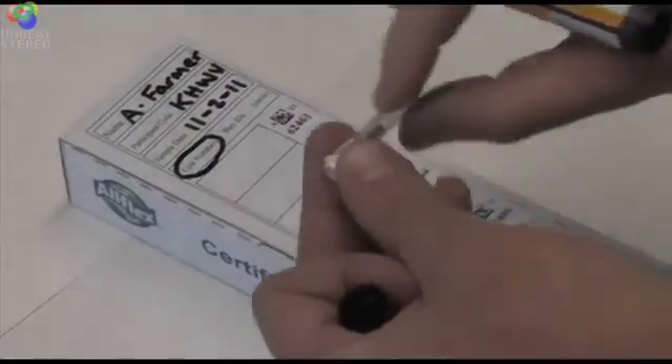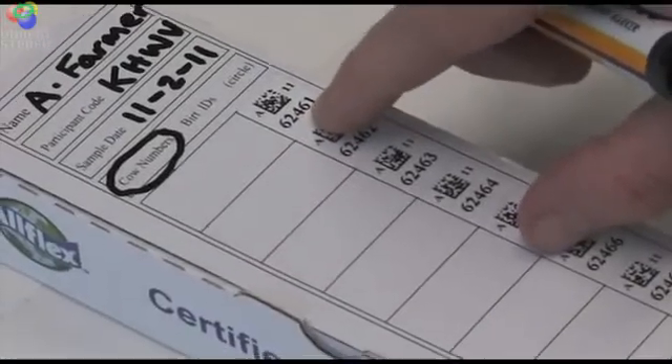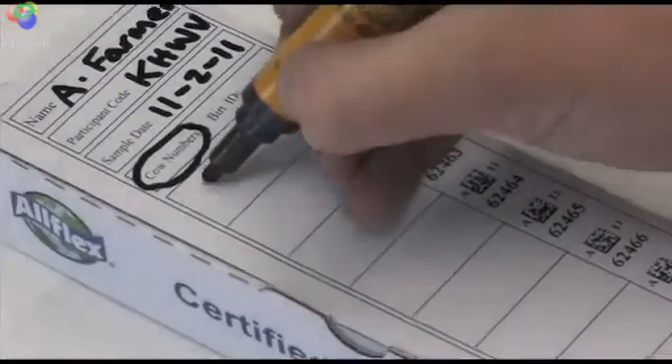As you go, you can identify on the side of the tubes a barcode number. You can search down the list, find that barcode number, and fill in the name of the animal.